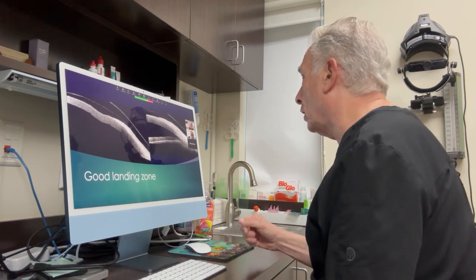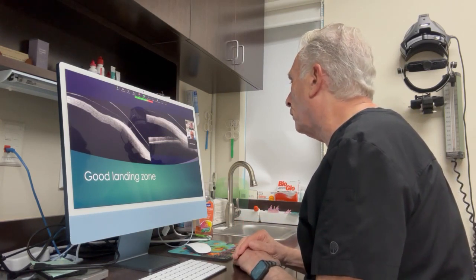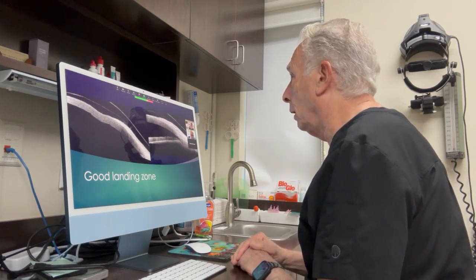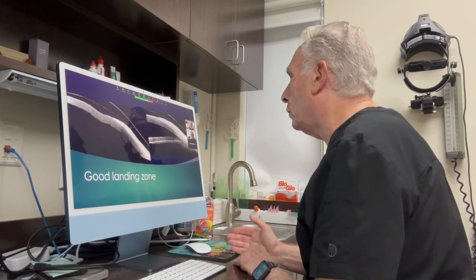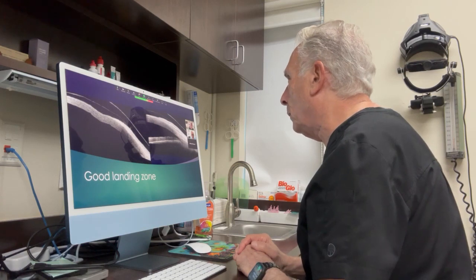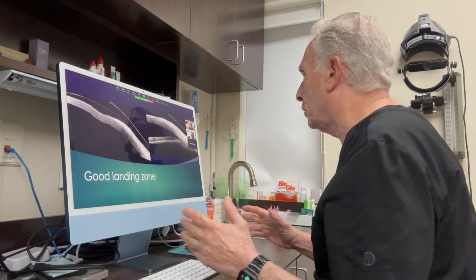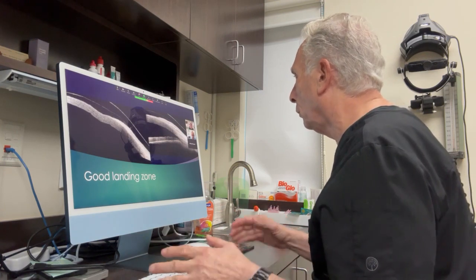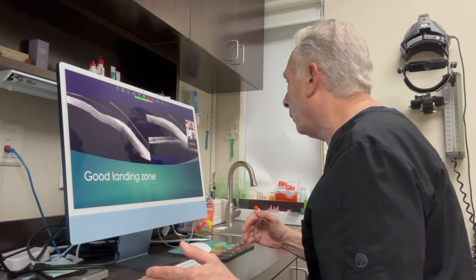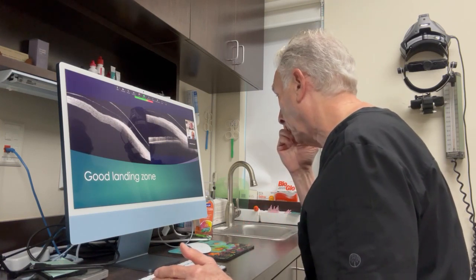On my regular scleral lens designs, forgetting about the eye print, I always fit lenses with reverse geometry. Usually the secondary curve is four diopters steeper than the base curve. So my regular standard scleral lens designs are all reverse geometry. That helps me give a lift over the limbus. It just makes for a better fitting lens, and I don't get edge lift that way.